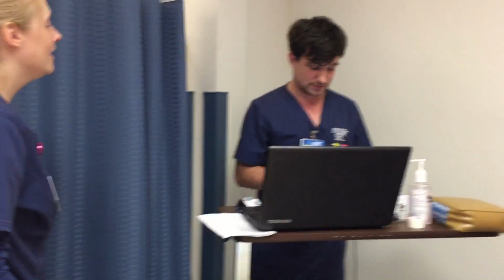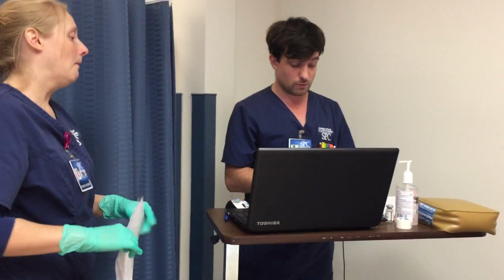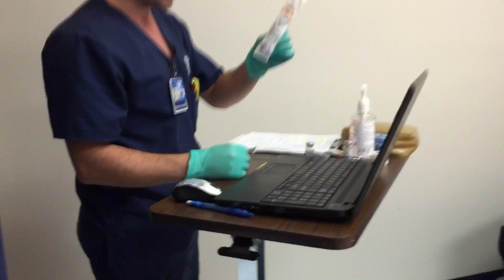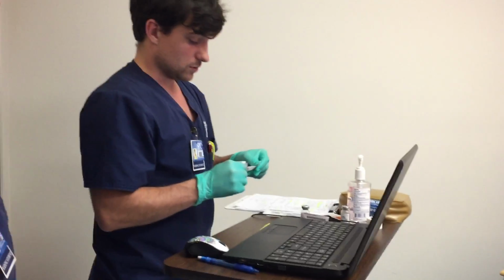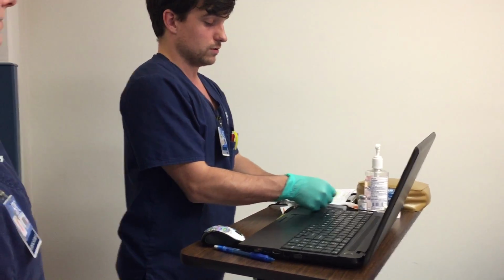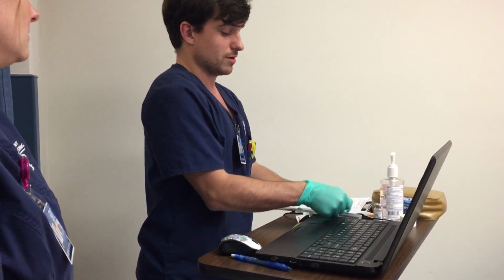Okay, so first thing we're going to do when we're giving this med is check to make sure that everything is not contraindicated here, and it's not. We're going to also swab the top of this, scrub the hub if you will. Keep that on there for 15 seconds, just scrubbing away, okay?